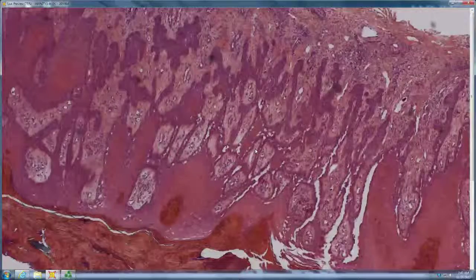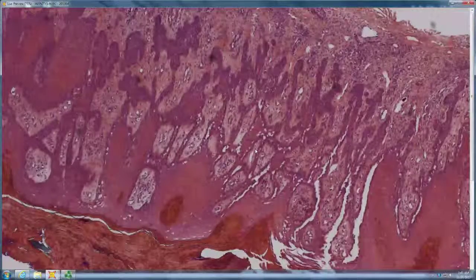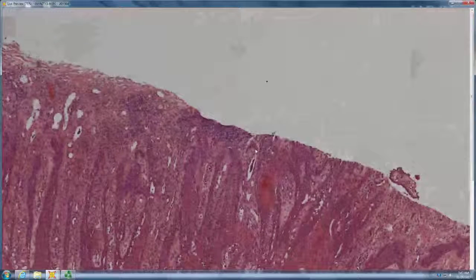It's localized. It's 99% women. Rarely you'll see it on a scrotum. It's almost always vulvar. Does syphilis look like that? Syphilis gives you elongation of rete in many cases, but does not give you acantholytic dyskeratosis.